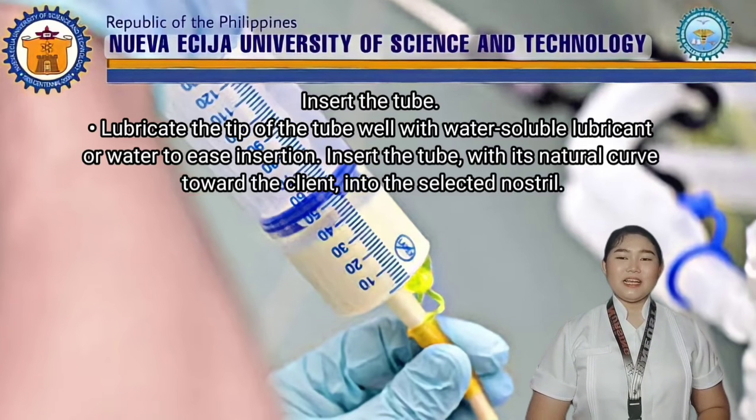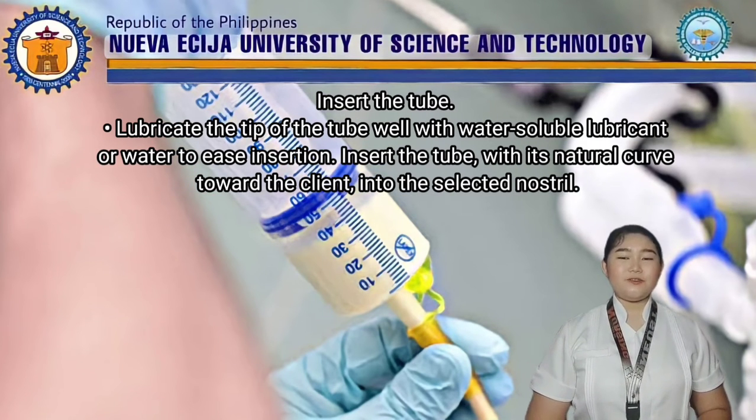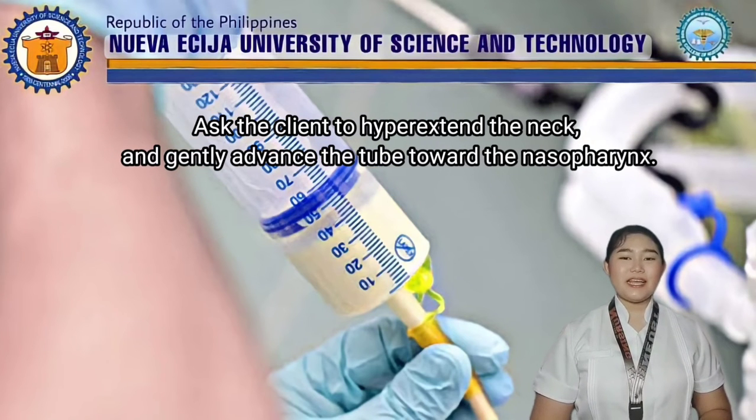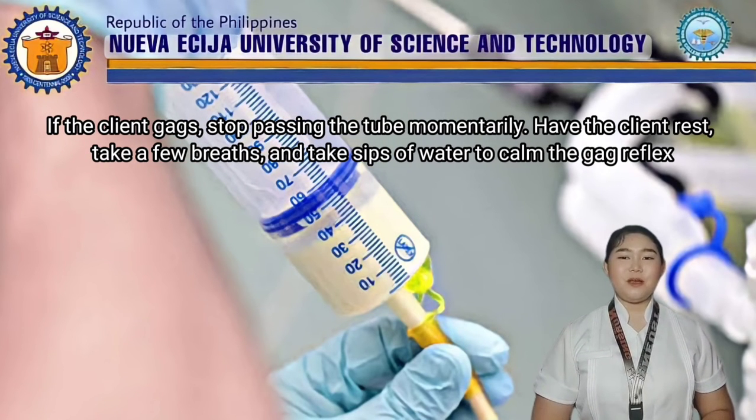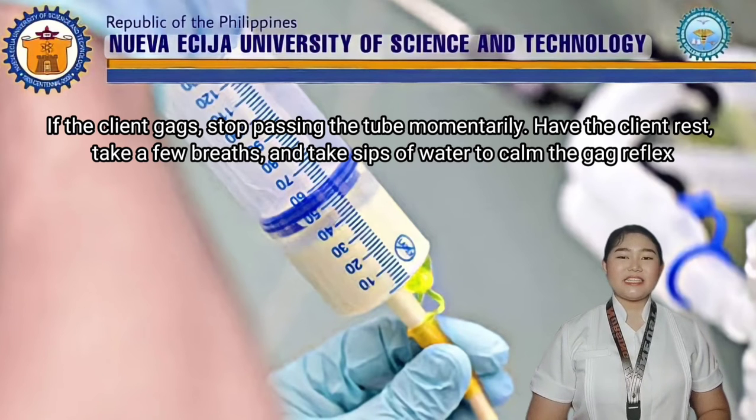Insert the tube. Lubricate the tip of the tube well with water-soluble lubricant or water to ease insertion. Insert the tube with its natural curve toward the client into the selected nostril. Ask the client to hyperextend the neck and gently advance the tube toward the nasopharynx. If the client gags, stop passing the tube momentarily. Have the client rest, take a few breaths, and take sips of water to calm the gag reflex.